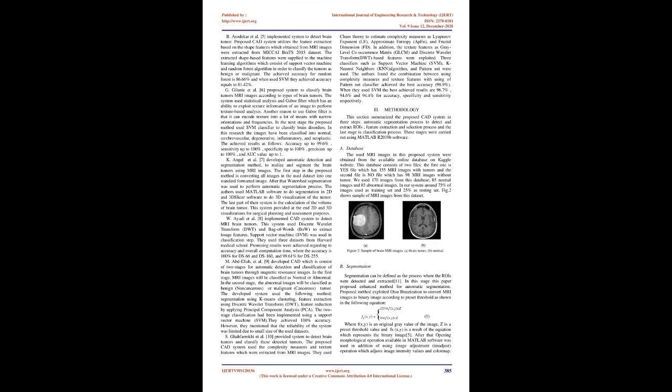In the first phase, MRI images are pre-processed. Post-processing is the second phase. Operations such as segmentation, morphological enhancement, and feature extraction are performed. The final phase is the designing of the neural networks by using feed-forward backpropagation with supervised learning. The results and the performance of the system are promising, where the accuracy of the system is equal to 99%, and the achieved sensitivity is equal to 97.9%.